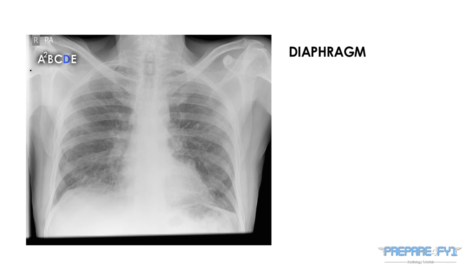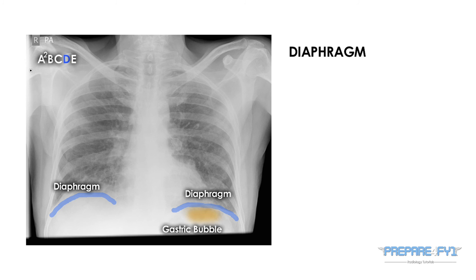D is for diaphragm. Here you can see the diaphragm on the left overlying the stomach, with the gastric bubble visible. On the right, the diaphragm overlies the liver. The diaphragm may be raised on one side or the other as a consequence of pathologies such as phrenic nerve palsy. If you see a gas bubble under the right side of the diaphragm, this may represent perforation of an abdominal viscus.